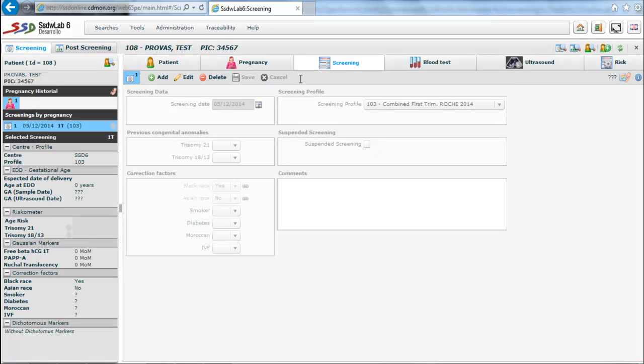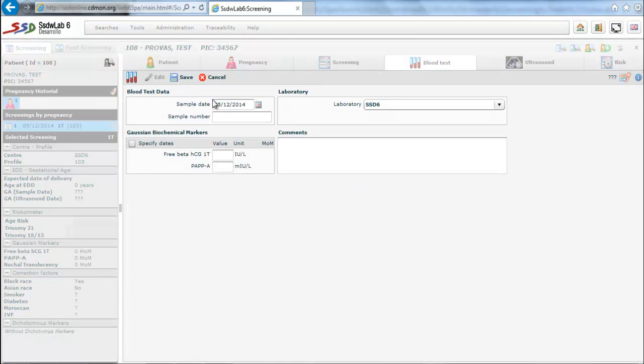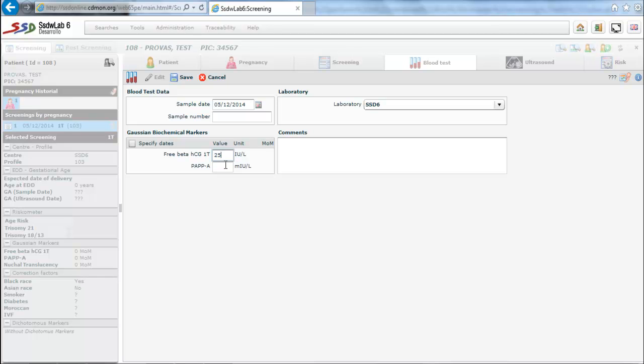The following is blood test folder. We enter the date of the sample, which normally coincides with the date of screening. We will also enter the values of Gaussian biochemical markers that in this screening profile are chorionic gonadotropin beta with its free fraction and pregnancy associated plasma protein A.